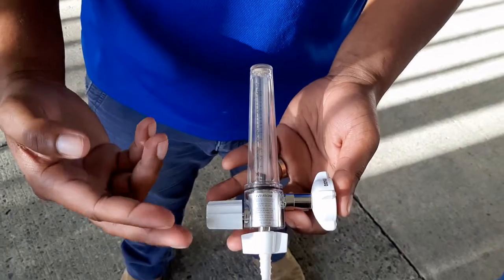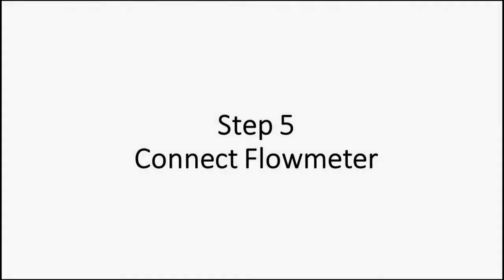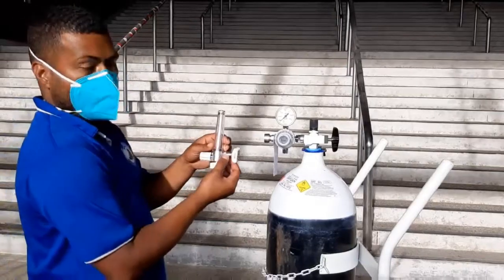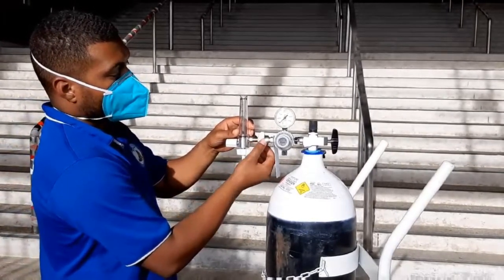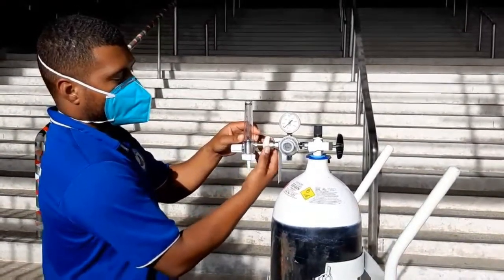What I have here is an oxygen flow meter with 0 to 15 liters per minute. We connect the flow meter, align it towards the port for the regulator, and then twist it clockwise in order to secure it.